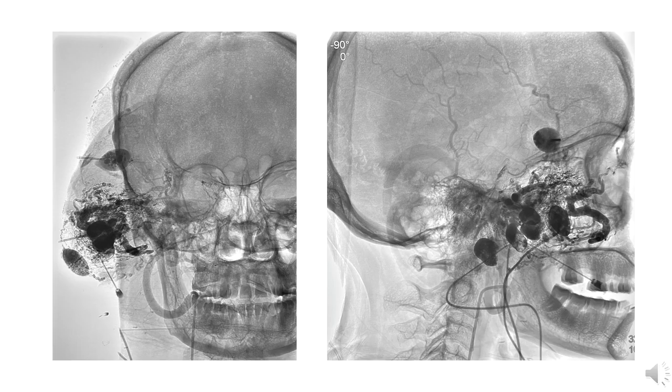Native unsubtracted fluorospot images. We can see here there's an interesting finding. So there are three more blobs of contrast or glue. One of them was glue at the bottom. Others are contrast, which we inject and then try to see where the contrast is going, but it's just going into the parenchyma, not into a vessel. So this is a very important image to understand that unless we have a runoff into the vessel, we should not further inject glue. And so we keep trying.